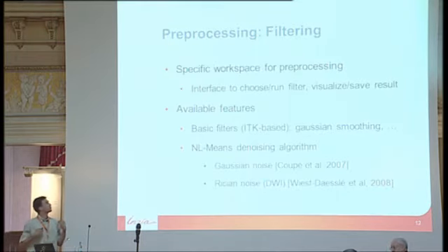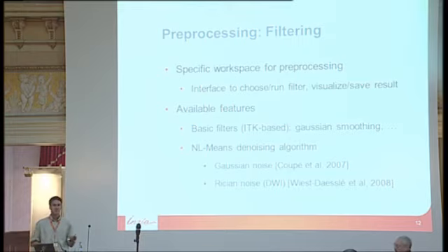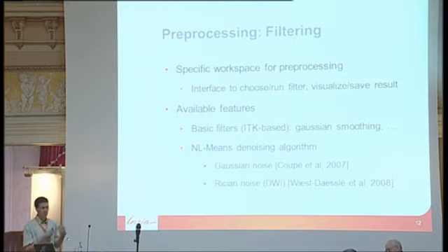Then going on to pre-processing, well, basically this is the filtering workspace. So there is a specific workspace for it, and you have an interface to choose and run a filter, to visualize your result, to save it if you want to keep it. You have several available features right now.